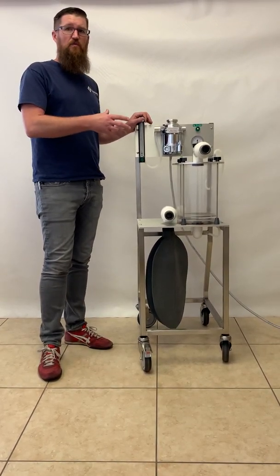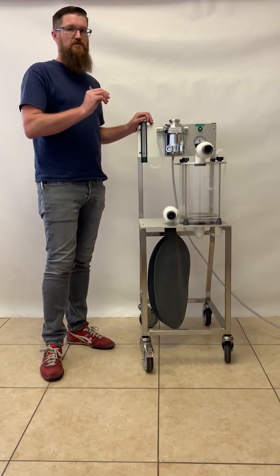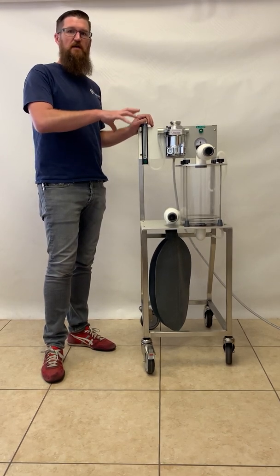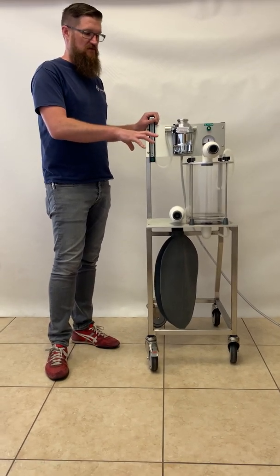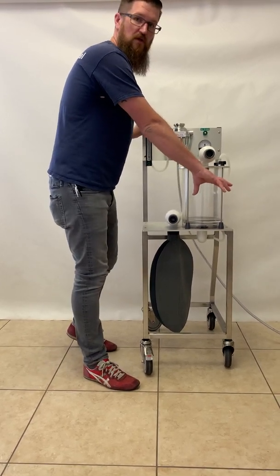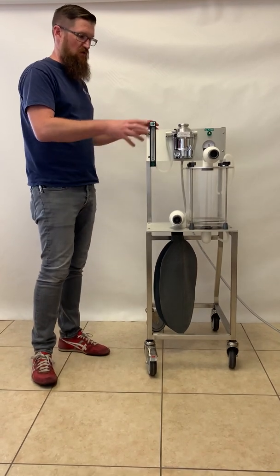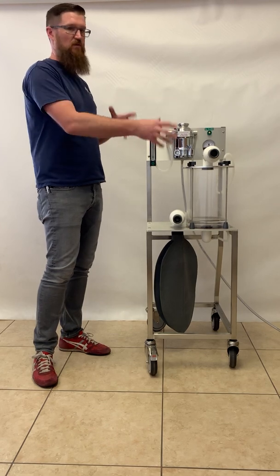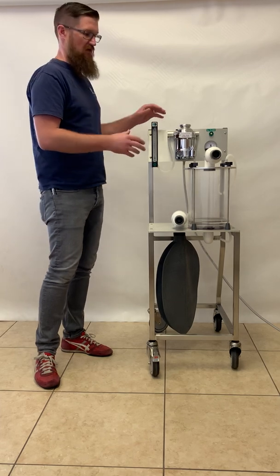This is a standard LAPD-1000, a little bit of a newer version, so a couple of slight differences, but it operates exactly the same. The only difference between this model and the machine that you currently have is that this is a standard LAPD-1000. It does not have a small animal circle system absorber like yours does mounted to the front, but all operations are going to be the same. So we're going to go over the components of your machine, but we will leave out that part, and I will explain how that works at the very end.